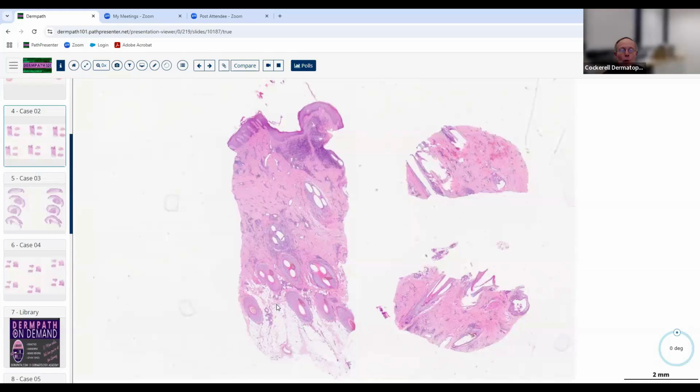And is this the normal number of follicles here in subcutaneous fat? No, it's a lot of follicles in the subcutaneous fat. It's more than normal. Well, actually, no, believe it or not, it's actually diminished. Oh, it's less. Normally we should see about 7 or 8 probably in a punch biopsy of this size. We see 4 here. These used to be down there, most likely. These probably were there not too long ago, but something's going on with them.